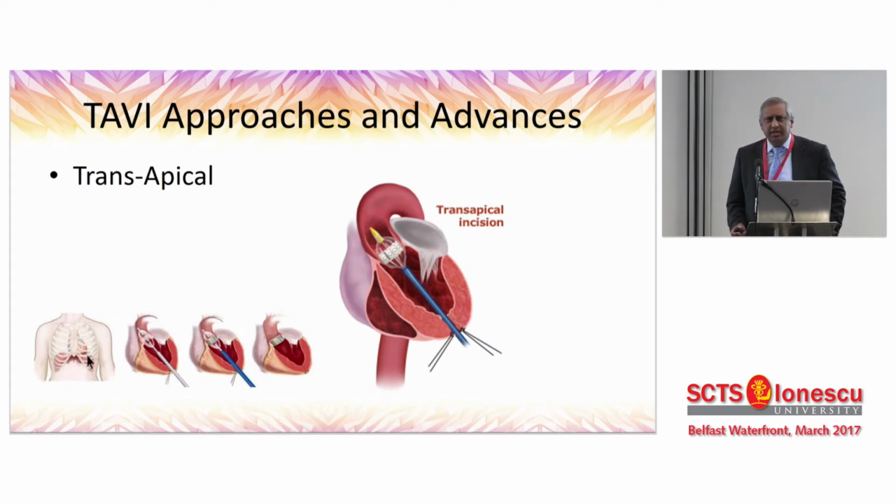Trans-Apical, I'm not too sure whether anybody is doing Trans-Apical anymore for TAVI. It is much more invasive, and the Achilles heel is certainly the entry point in the ventricle, which can give you a lot of trouble in terms of bleeding and occasionally pseudoaneurysm formation. However, the Trans-Apical approach probably will become more popular again once the mitral valve prostheses get on the way. But I think for TAVI itself, very rarely are we having to use the Trans-Apical approach.